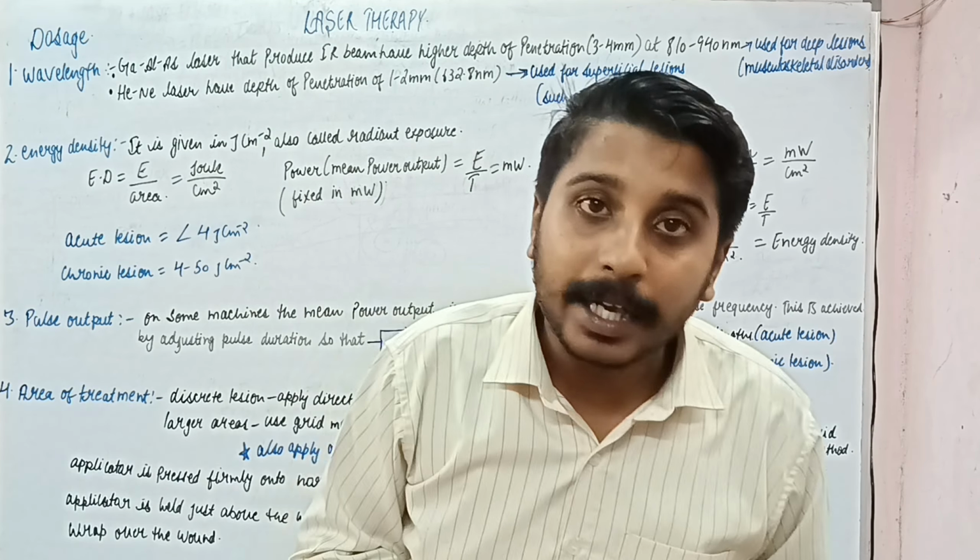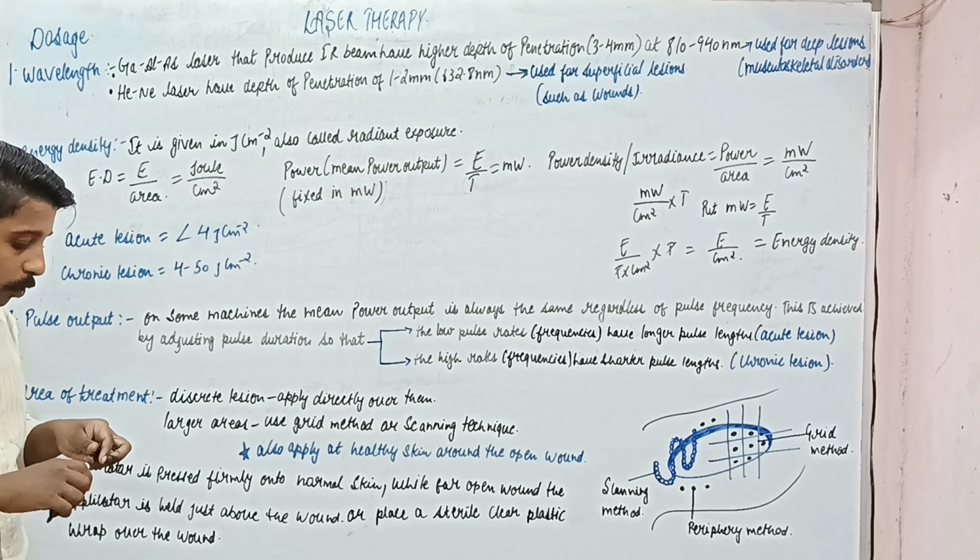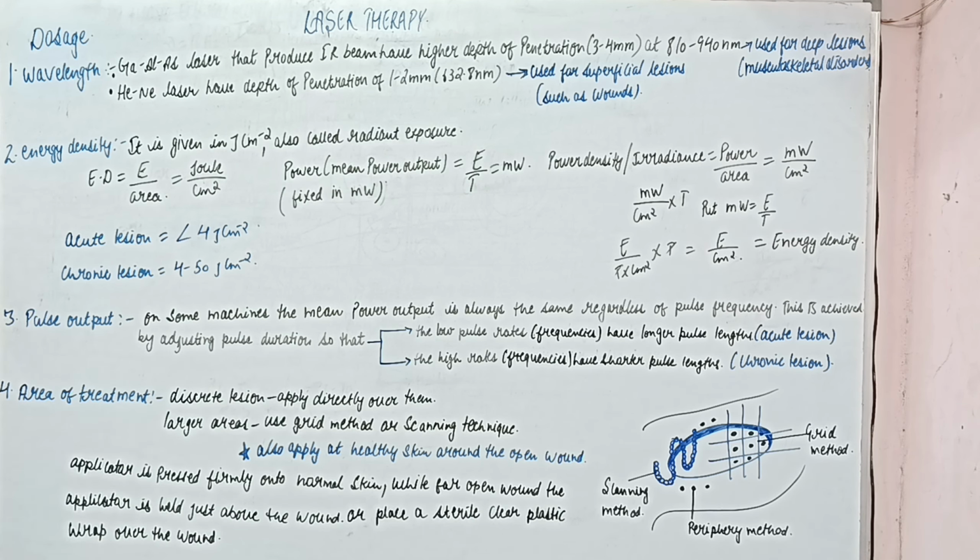The dosage of laser is not well justified. According to some studies, I have written some general ways to find the dosage of laser irradiation to a patient. Its dosage depends upon certain factors. The first is wavelength.